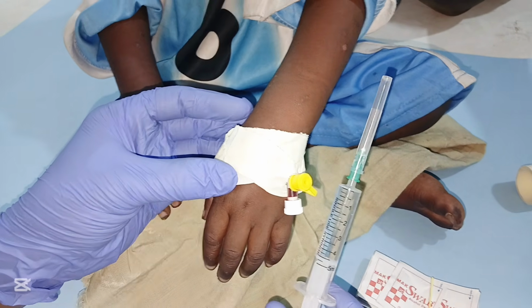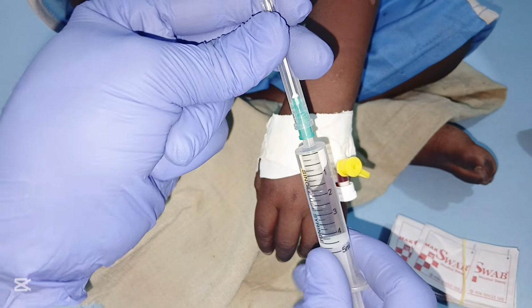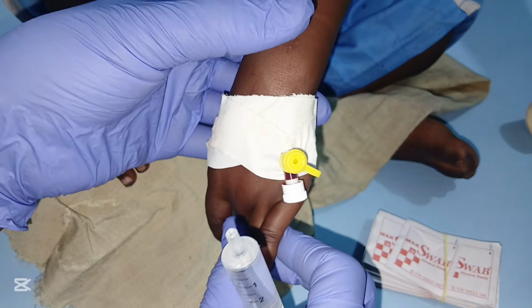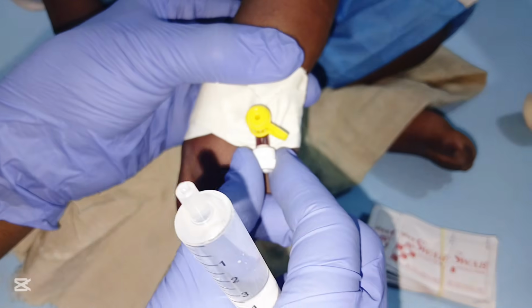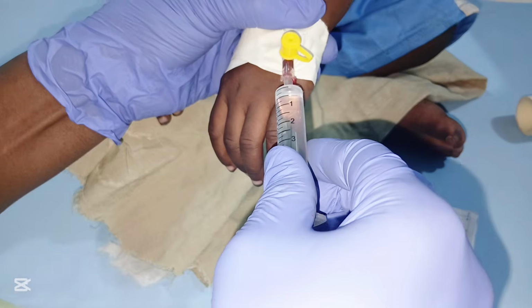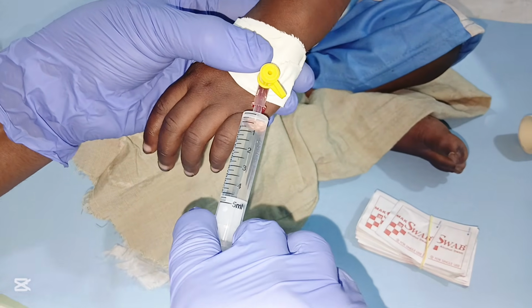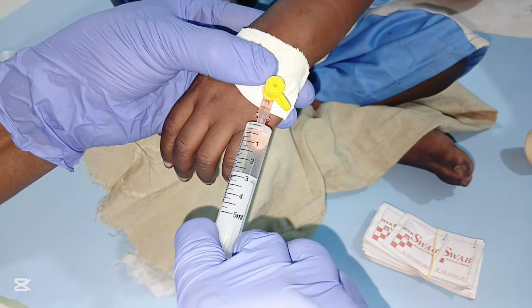Then finally, you get sterile water for injection. You flush the cannula. You remove the cap of the needle from the syringe. Make sure you apply pressure to control bleeding. Then you remove the cap of the cannula. So this is how you are going to flush the cannula. You put the syringe into the opening of the cannula. Then you push the plunger to flush the cannula.